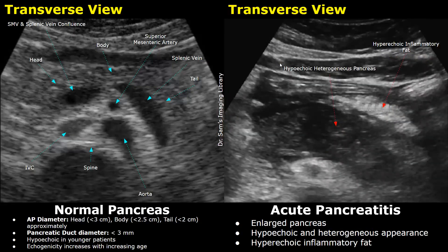In some cases of acute pancreatitis, you may find an enlarged, hypoechoic, and heterogeneous pancreas. Another feature to note is the hyperechoic inflammatory fat seen next to the pancreas.